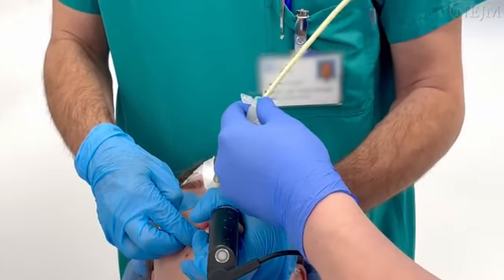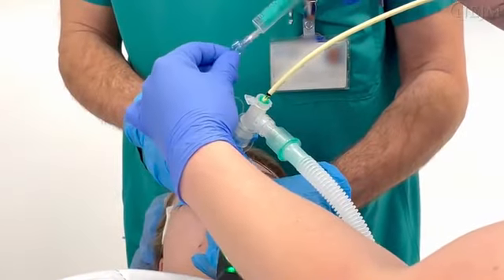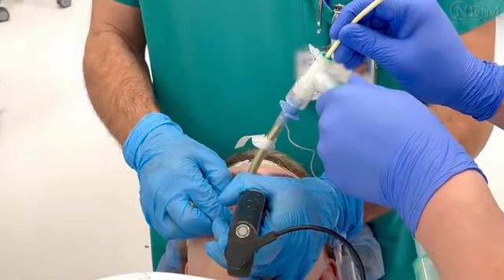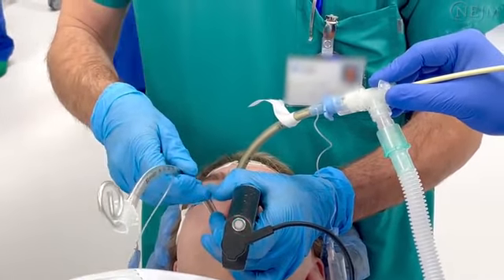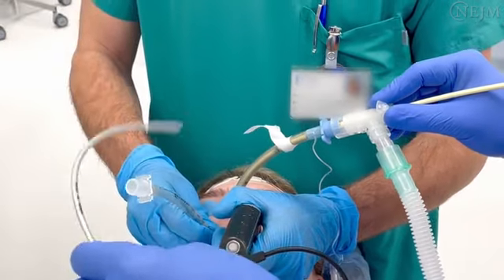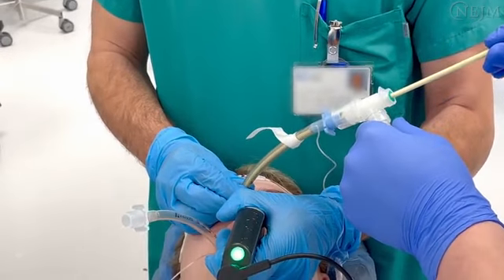Endotracheal tube exchange is an important part of airway management in patients in intensive care units, operating theaters, and emergency departments. In most cases, the procedure involves replacement of either an oral tube or a nasal tube with a new oral tube. The choice of equipment and technique depends primarily on the experience and preference of the physician.